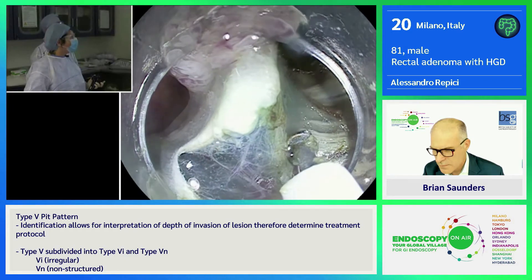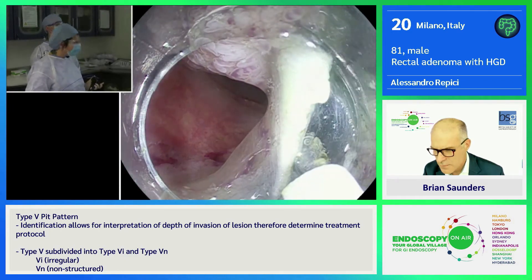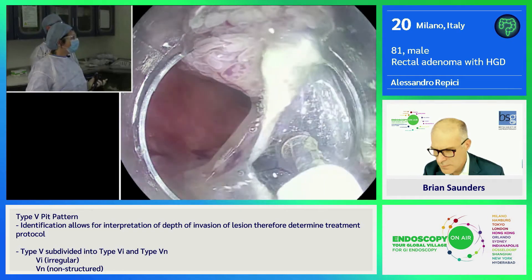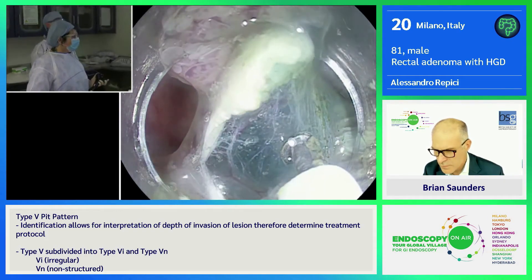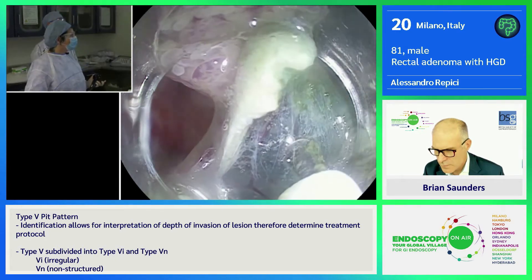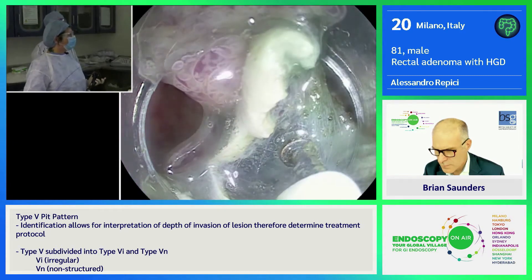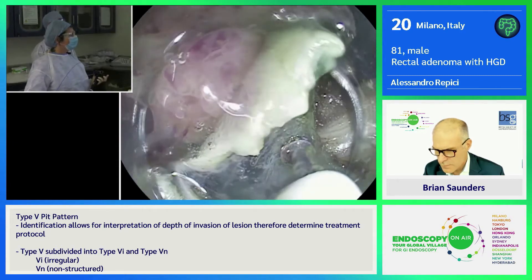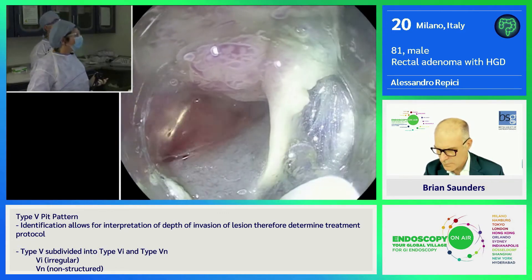Also another coagulation modality, which is Precise. I really like it because, as the name says, it's really precise — it's a coagulation setting exactly. Nice traction, so you can keep going cutting as long as you want. What about this Pentax scope — what is the maneuverability?